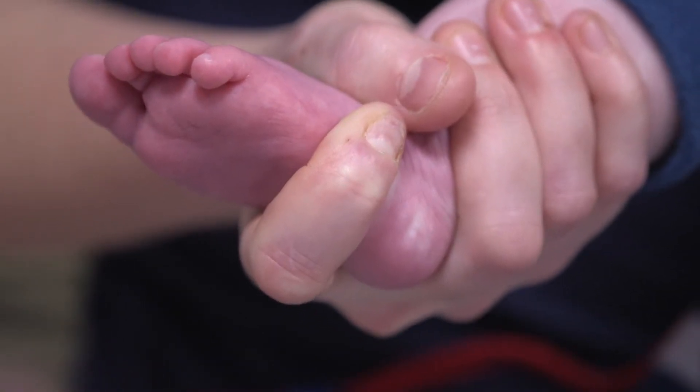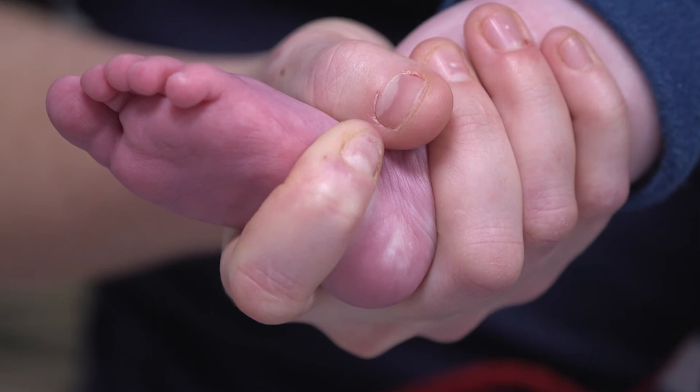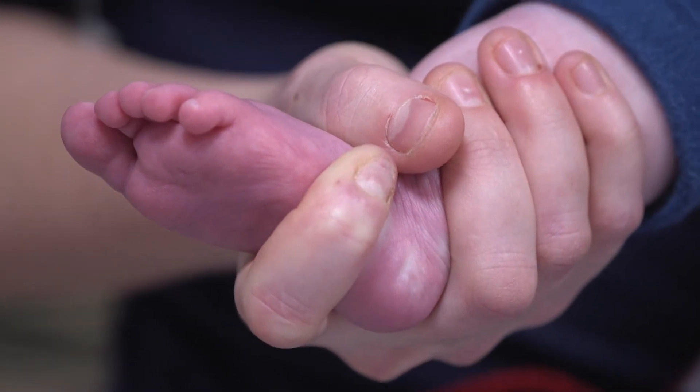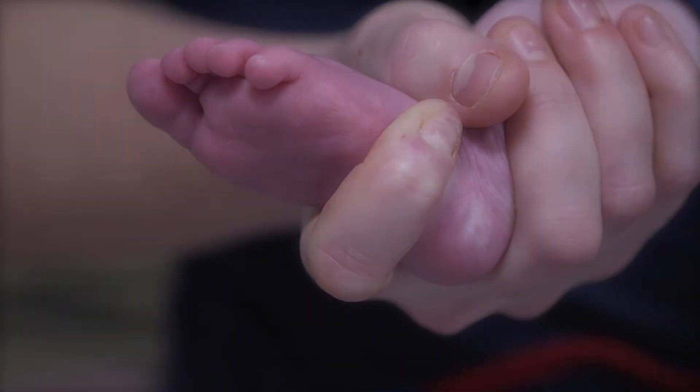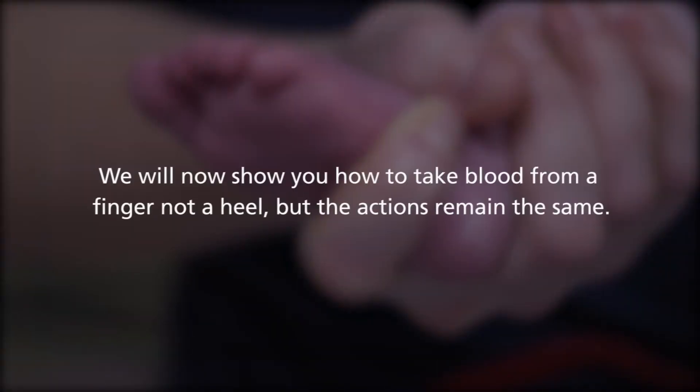When taking blood from baby's heel, have a safe but firm hold of the baby and hold the heel like so. Have the leg and the foot facing down so gravity can help with the flow of blood. We will now show you how to take blood from a finger, not a heel, but the actions remain the same.